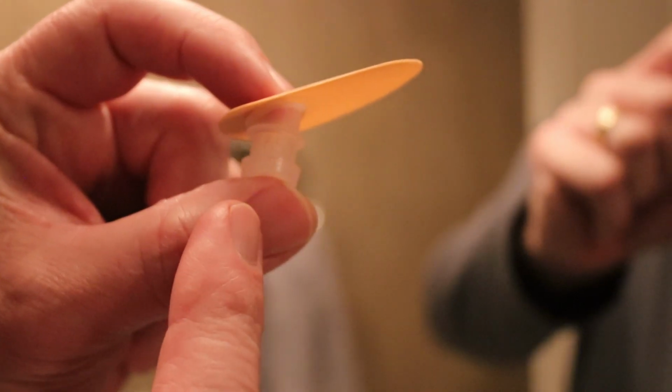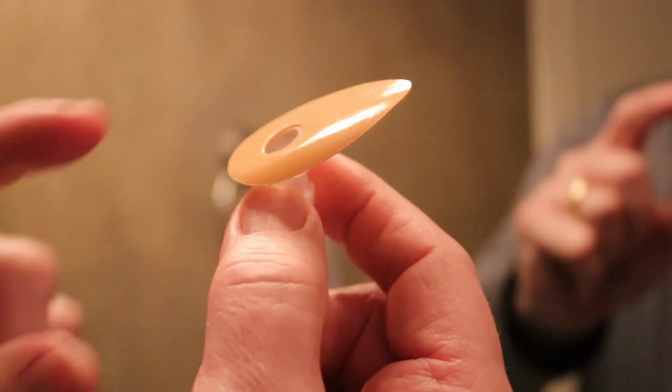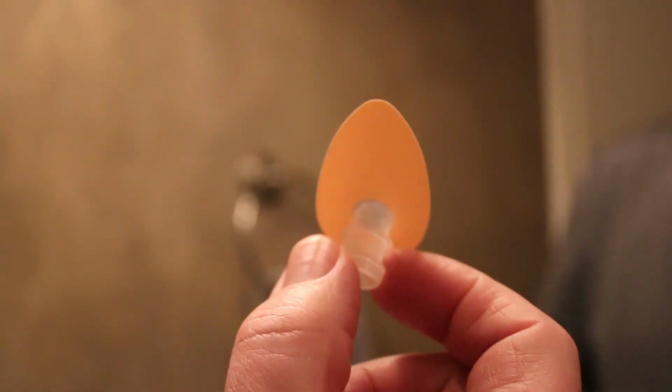So when you put these on, the goal is to line the port up, which is on a 25-degree angle, so that when you're putting these in place, you want to occlude the nostril so that this is coming straight down. The tape is going to point off in a different direction, and we're going to talk about that here in just a moment. But what's additionally unique is that the port has a distal edge at the bottom. That distal edge is what's going to connect into the QR socket, and what the 4 hooks inside the QR socket are going to attach to when you rotate it around and it snaps onto the end.